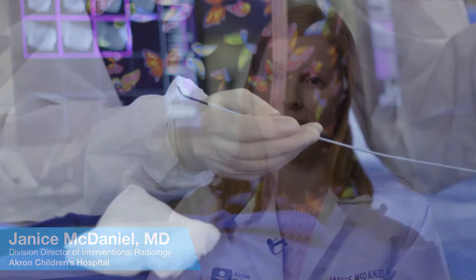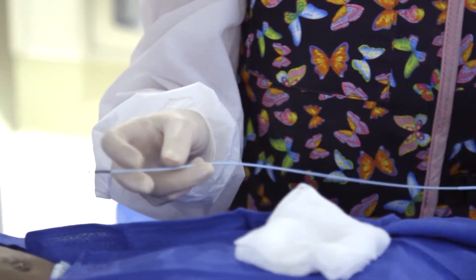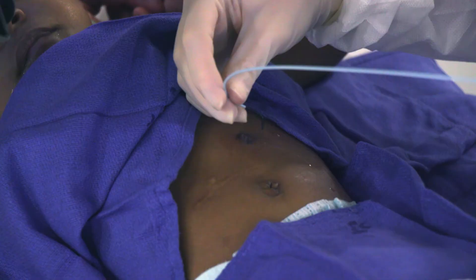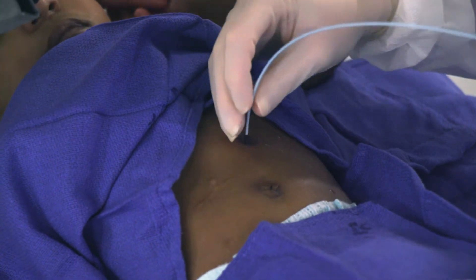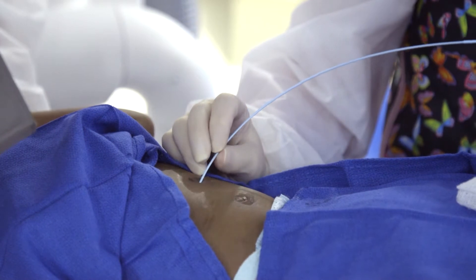For an initial G-tube to G-J conversion, what I first attempt on a small child or infant will be just to preload the gastrojejunostomy tube with a Benson guide wire, with the floppy tip coming out of the tip of the catheter. Then I will put that through the gastrostomy stoma and try to direct it across the pylorus, repeatedly advancing the guide wire a few centimeters past the tip in an attempt to cross the pylorus into the proximal small bowel. That works most of the time.